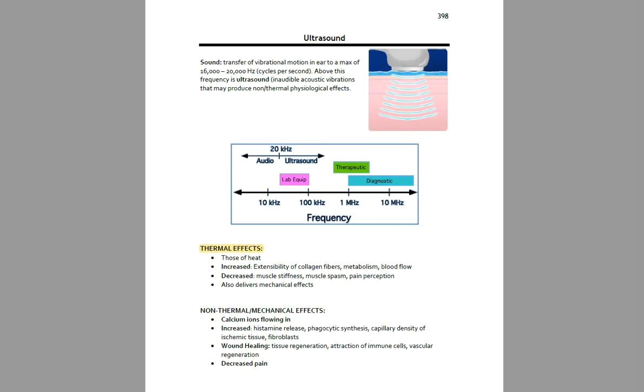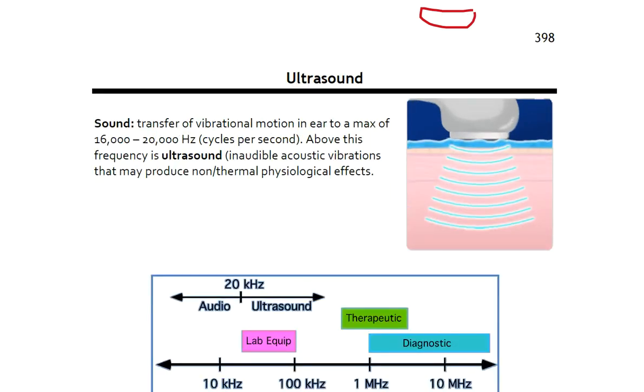All right, well, let's talk about therapeutic ultrasound as it's related to performance in clinics and other healthcare settings. This will follow along the guide, page 398 of the guide, and I'm just going to zoom in a little bit here so we can talk more about this.